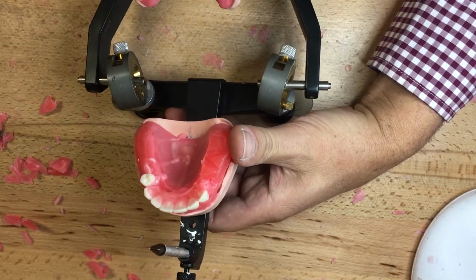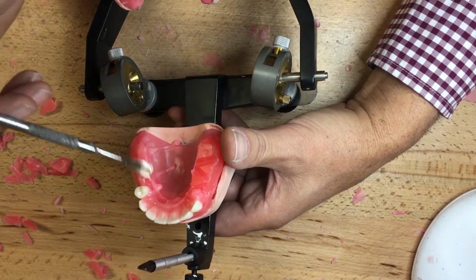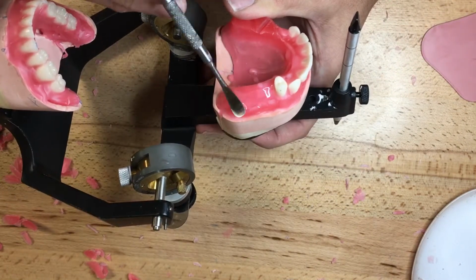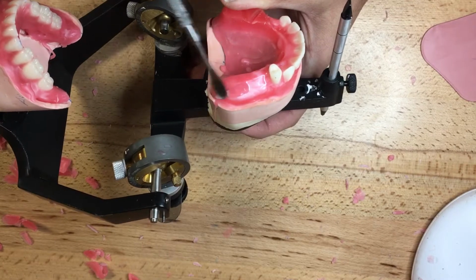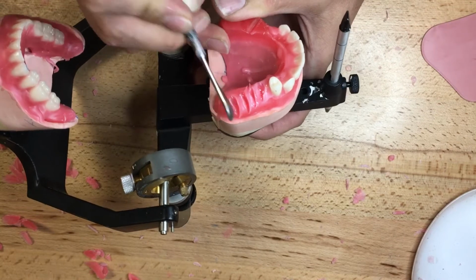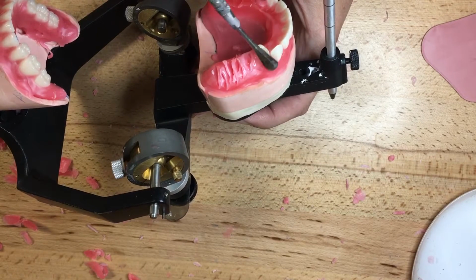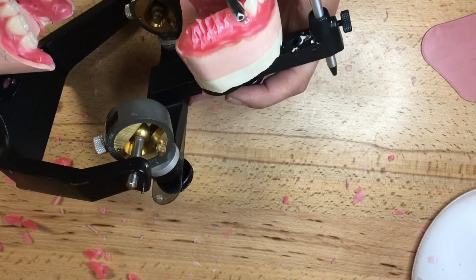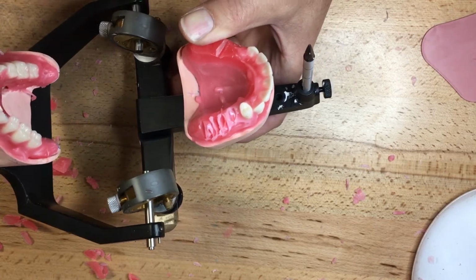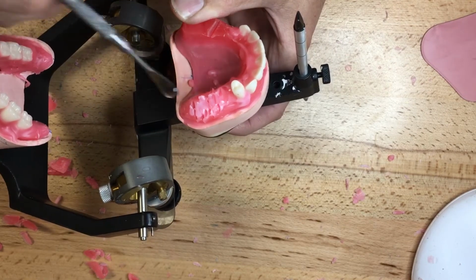Okay, now you might be saying, well, isn't that the contour of the bite block? Possibly, but we're talking there is some freedom in the location of the anterior teeth. I mean, how exact was the practitioner in sculpting the labial contour of the occlusion rim? I still have some freedom of up to a millimeter each way. I'd like to think I do. And I have data to prove that from actual treatment plans done with patients.